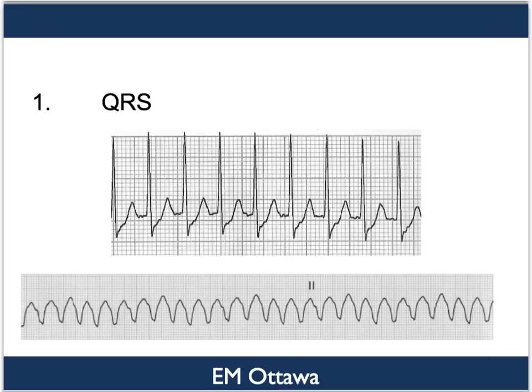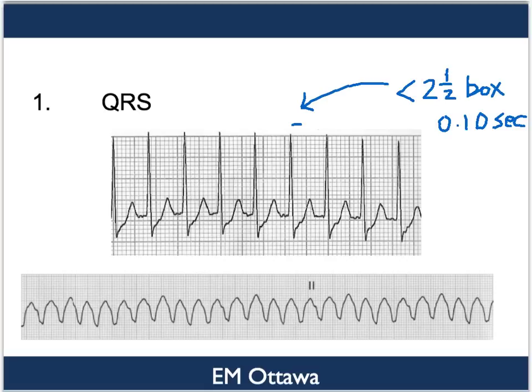First, we will look at how to determine whether the QRS is narrow or wide. A narrow QRS is a QRS complex that measures from the beginning of Q to the end of S that is narrower than 0.1 seconds or 2.5 small boxes. You can see in the top rhythm strip the QRS is narrow, whereas in the bottom rhythm strip you can see there is a wide QRS because the complexes are wider than 0.1 seconds or 2.5 boxes.